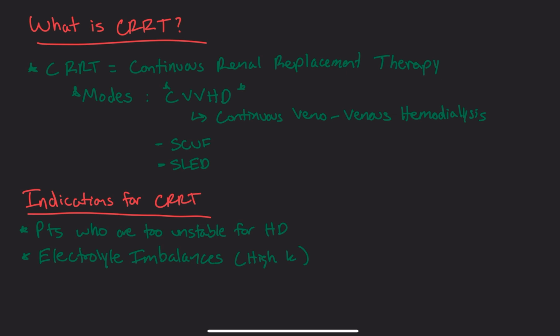You'll see it for chronic kidney failure patients, or for patients with acute kidney injury, with elevated creatinine, elevated BUN, and decreased or no urine output at all. It can also be used for removal of toxins and waste, cleansing the blood as well.